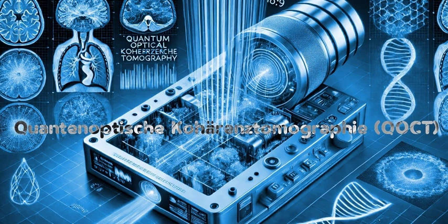Classical OCT popped up in the 90s? Around then. It became really important, especially in ophthalmology, for looking at layers in the eye, that kind of thing. And it works by sending light in and seeing how it bounces back, right? Using the coherence of the light. Pretty much. It measures the interference of light waves returning from different depths to build up a cross-section image.